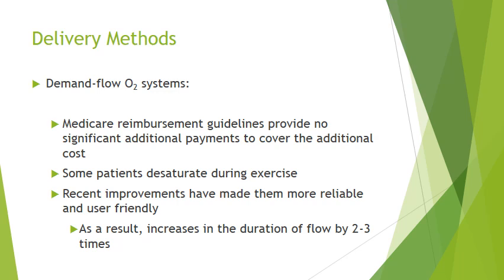However, if the patient exerts themselves during exercise, they may desaturate with the demand flow because it's not giving continuous flow, and you tend to inhale a lot deeper and have more need for flow when you exercise. If you have a patient that is lung compromised, that can probably be a problem compared to someone who does not have lung disease.